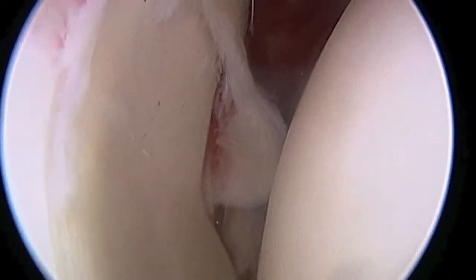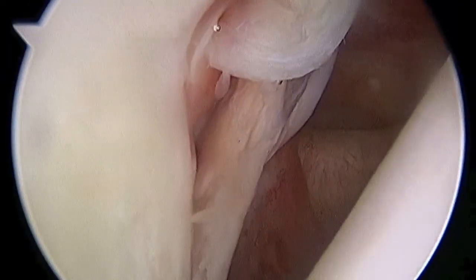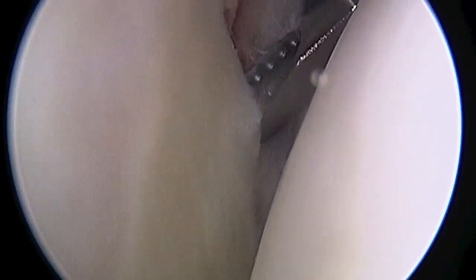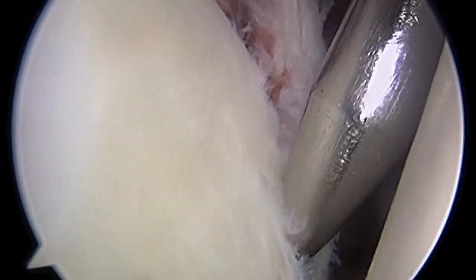Here we have the shoulder of a 17-year-old who dislocated it as he was sliding into home plate. As I push the shoulder forward, you can see the Hill-Sachs lesion on the back of the humeral head there, and in the front of your screen you can also see the labral tear where the ligament is torn away from bone. As we get a closer look, you'll also be able to see the inferior glenohumeral ligament in the bottom right-hand corner of your screen attached to that labrum. The first thing we're going to do is shave away any loose soft tissue or early healing scar tissue that's developed, and freshen up the bone so that it's bleeding and will promote healing.